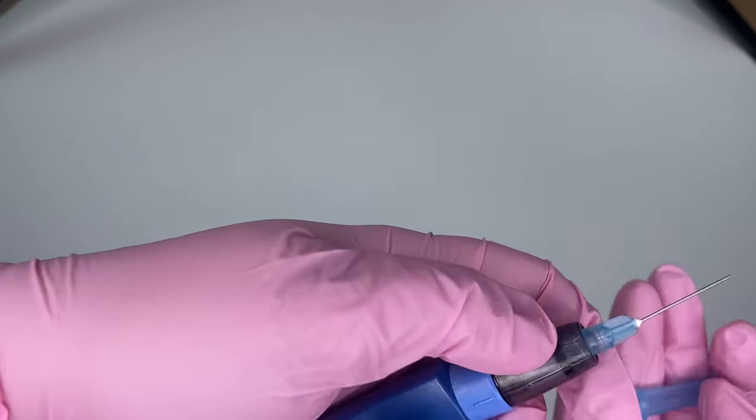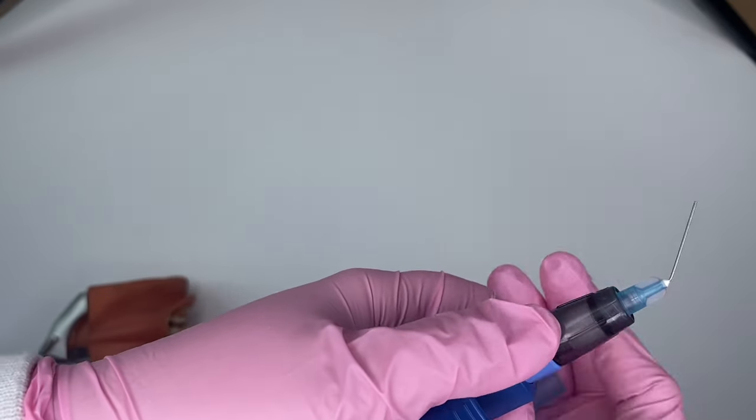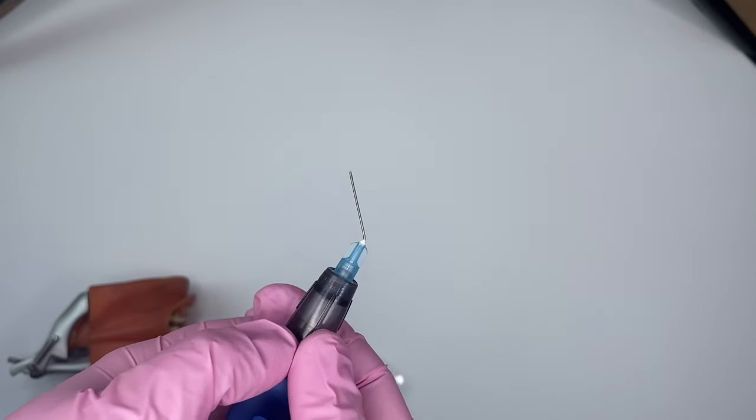What I like to do before placing it on a patient is bend this tip a little bit so I can have better access when using it.